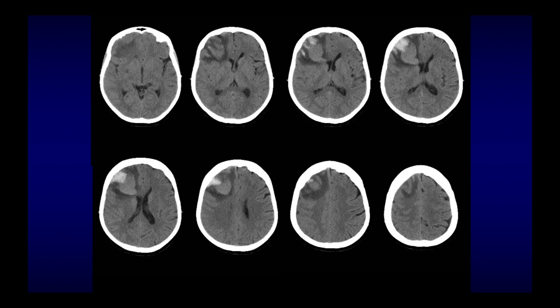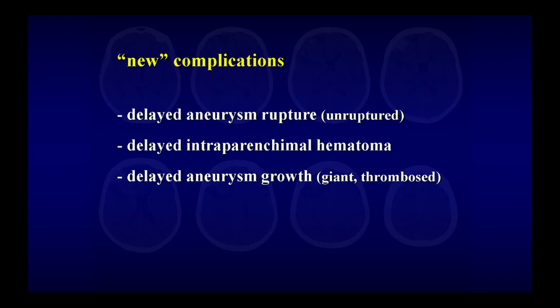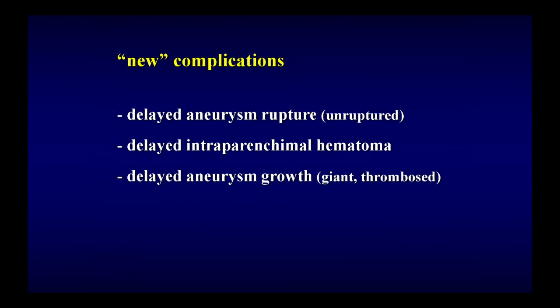And everybody was frightened at the beginning, but now with the coils and with the very good washing of the flow diverter before using it, we have really brought this complication down almost to nothing. This is the real one. We have cases where the aneurysm keeps on growing over time, even if we have put flow diverters. And especially these are the originally giant thrombosed aneurysms, that even if you put flow diverters, they continue to grow. We think because there is feeding from the wall of the aneurysm. So you have arteries on the wall of the aneurysm, the vasa vasorum, and we think that this is something that keeps the aneurysm growing, and you cannot do anything about it for now.